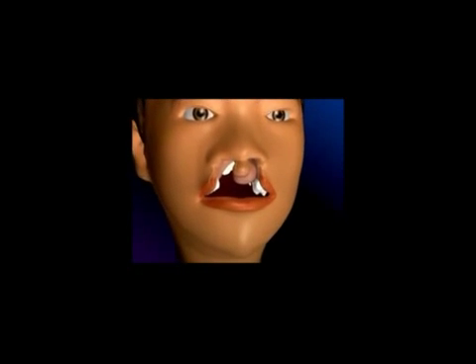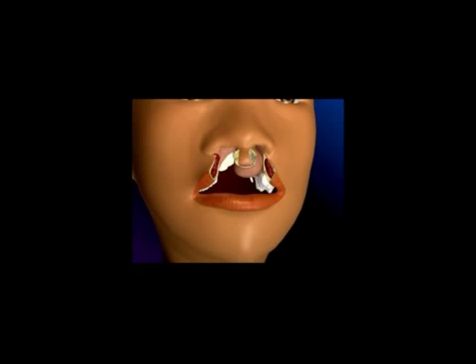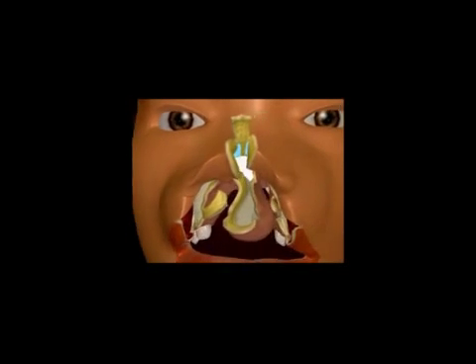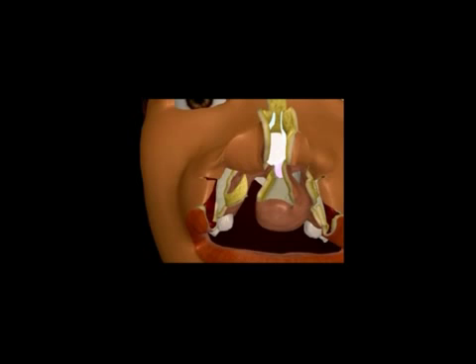If you have a bilateral cleft lip child, you'll have several concerns. Certainly the muscles of the lip will need to be put together correctly, but it's also important that the cartilages in the tip of the nose be corrected. Once they're put into normal position, as your child's nose grows, the shape of the nose will improve with time. Here a pair of scissors is being used to simply elevate the fat and skin away from the cartilages so that they can be brought up and together at the end. We'll close the inside of the lip and make sure to close the nasal floor so that there are no leaks between the mouth and nose. Here you can see a piece of tissue from the edge of the lip being used to close the nasal floor.